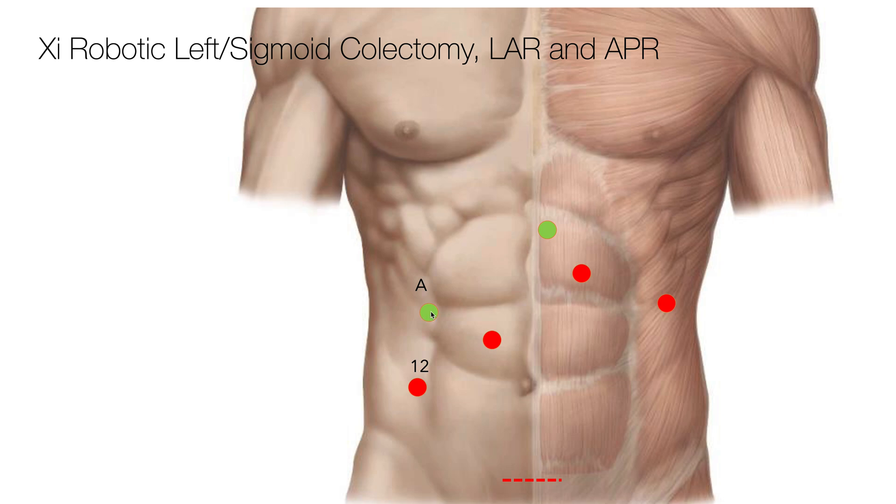This is an eight millimeter trocar so that it's easy to pass needles into the abdomen, and then I place a five millimeter trocar in the epigastrium just to the left of midline. I like that the assistant has two hands to use — it helps with retraction in several parts of the operation.